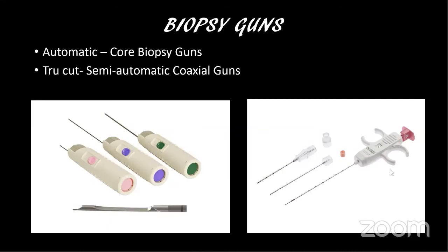Why? Because internationally it is recommended that all breast biopsies should be performed with a 14 gauge gun, so that a thick, nice core of tissue is obtained for a good histopathological diagnosis.